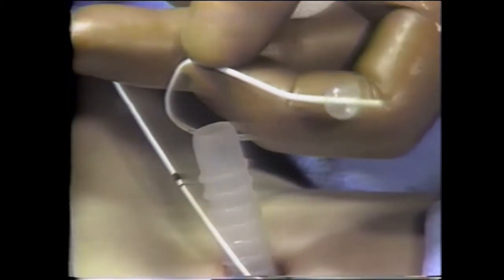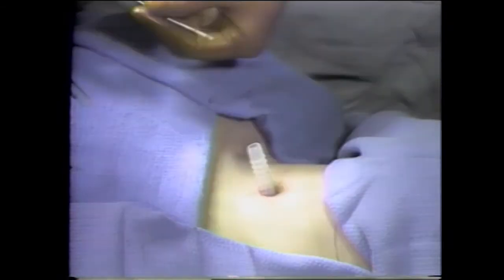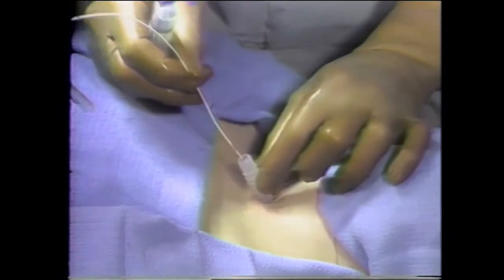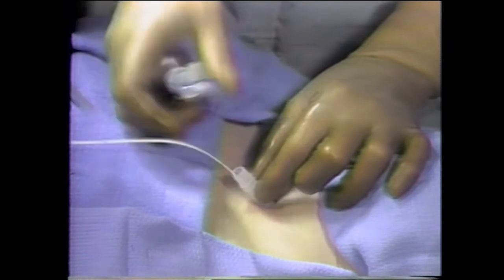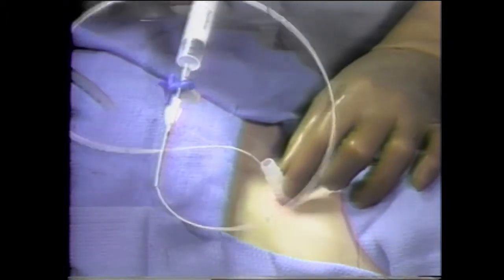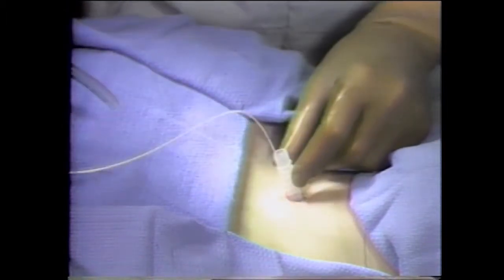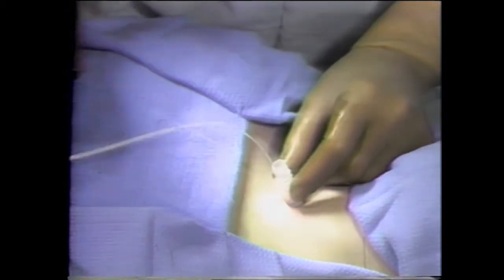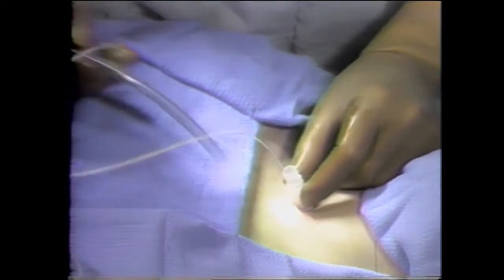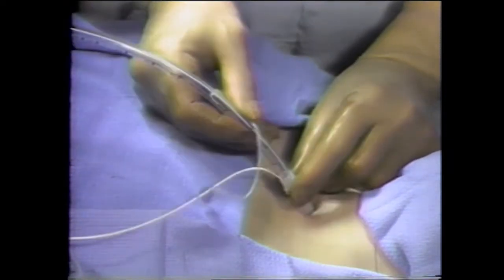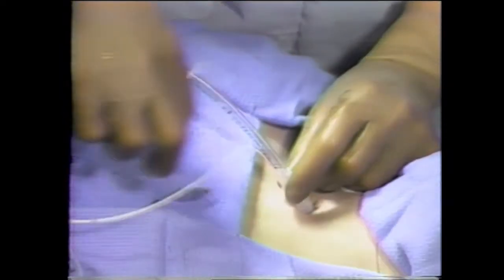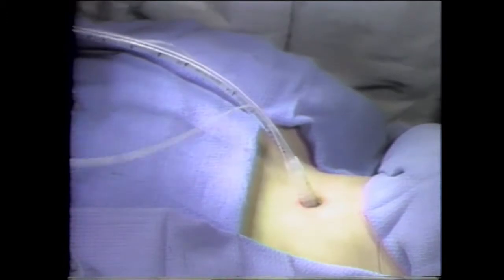The balloon is tested prior to its insertion into the safety tube. The catheter is inserted into the upper intraluminal portion, the balloon is inflated and the stopcock closed. An endotracheal tube is inserted into the extraluminal portion of the safety tube and a closed system is achieved.